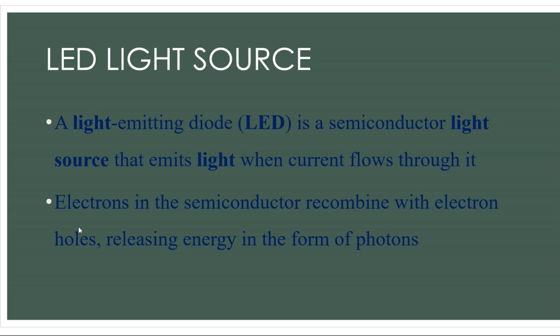The third type of light source, the halogen, nowadays we are not using it. It should not be used. Either xenon light source or LED light source is a better choice. Halogen light source was very commonly used previously, when LED and xenon light sources were not easily available. Then halogen light source, yes, was an economical option. But my recommendation is just go for either xenon light source or LED light source nowadays, right?